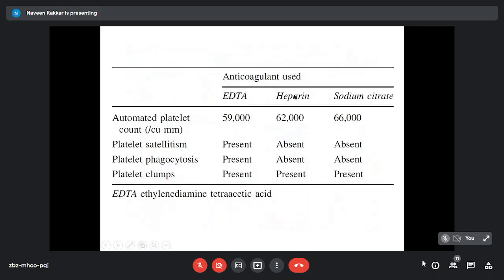Again, our friends, heparin and sodium citrate. Now, in this case, the counts didn't improve much. If you look, your platelet counts are similar. Usually, we expect an EDTA phenomena to open up in heparin or sodium citrate or both, but it did not happen much. Satellitism disappeared, phagocytosis disappeared, but the clumps remained. So again, we don't know, probably the immune process is causing the clumping, but because there were enough clumps, we could report a normal count manually. But the phagocytosis and satellitism disappeared.